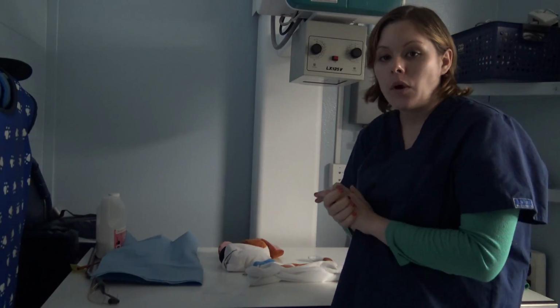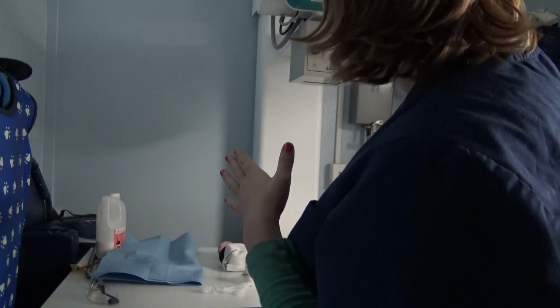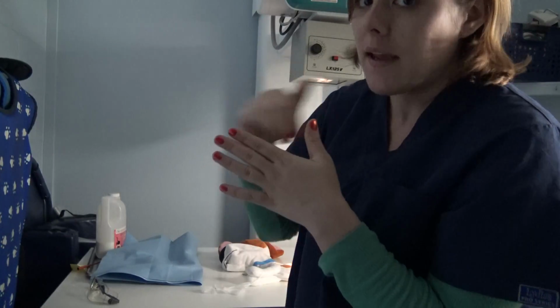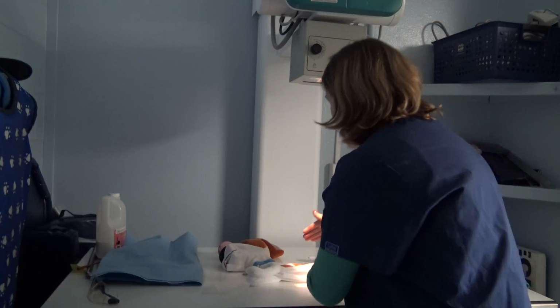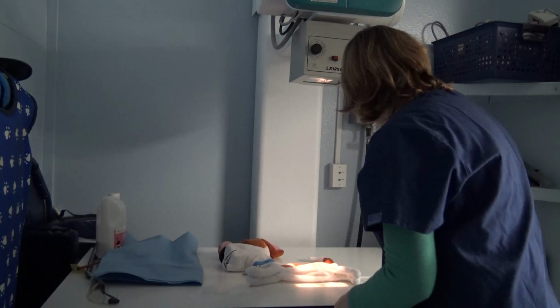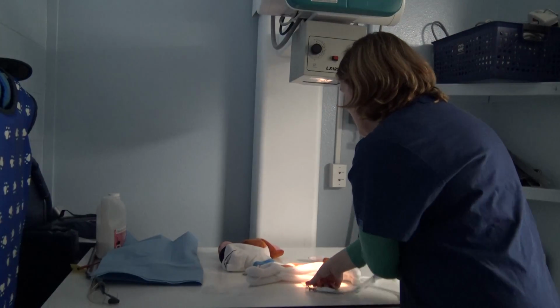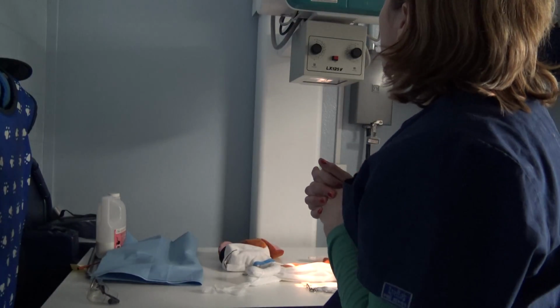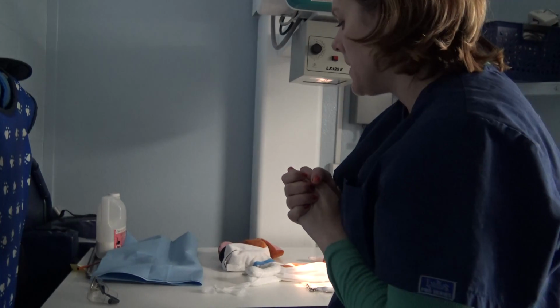And again, you want to make sure you measure at the 13th rib. You want your collimation to be about the diaphragm. You want the apex of the heart and the diaphragm to the coxofemoral joint. You want to make sure you have minimal dead space above and below. You want to make sure you have the right marker. Our patient has the same settings as before on the kVp and the mA, and the same measurement size because we're doing the same lateral repeat position.